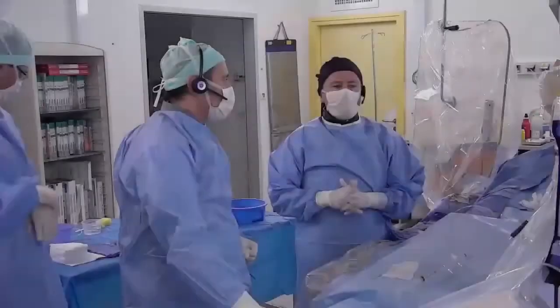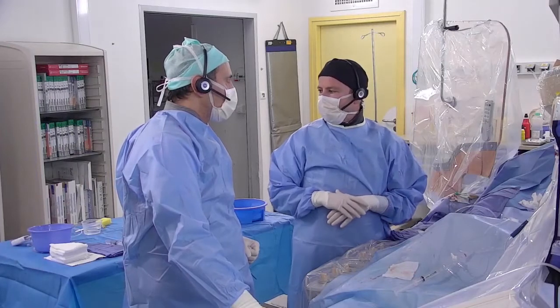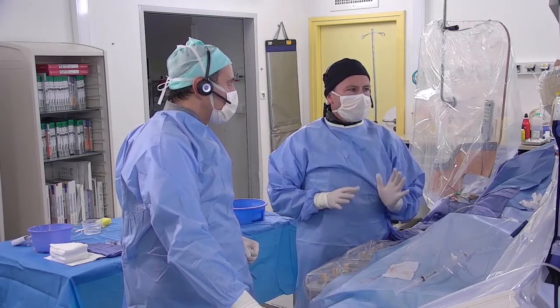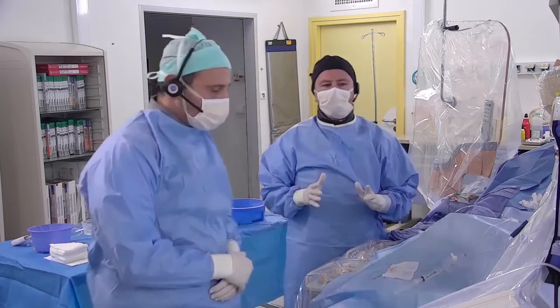For the layman, we can discuss using a larger burr, but I think to start it will be good. You know that there is a long lesion, so we need time to cross the lesion. So we have to prepare it. This is the ROTAPRO.